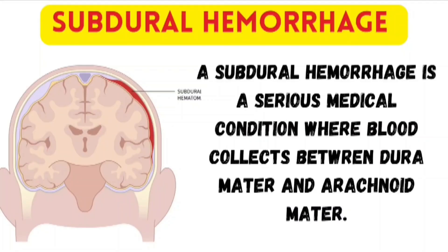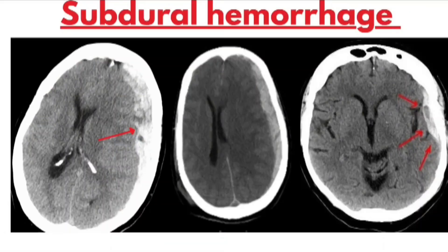Subdural hemorrhage, also known as subdural hematoma or SDH, is a serious condition where blood collects between the dura mater and the arachnoid mater. This bleeding usually occurs due to tearing of bridging veins, often after trauma. On CT scan, the red arrow points to a crescent-shaped hyperdense area along the surface of the brain. Unlike epidural hematomas which are lens-shaped, subdural hematomas spread more diffusely and can cross suture lines. A midline shift may also be visible, indicating pressure on the brain.